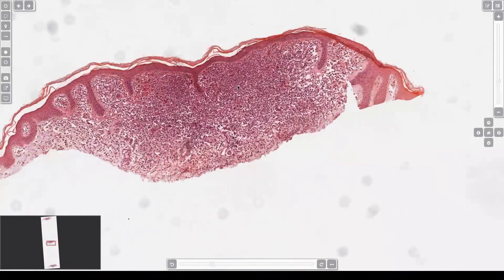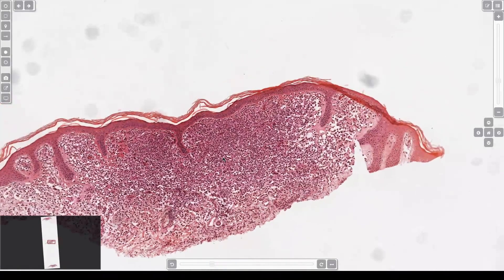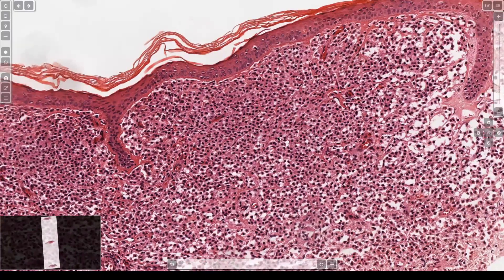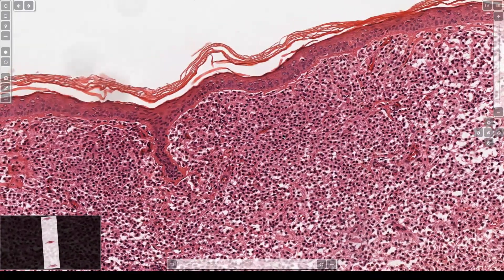Alright, dermal infiltrate — there are two types that tend to fill the papillary dermis: mastocytosis and Langerhans cell histiocytosis. The easy way to identify them, even without cytology, is the classic fried egg appearance, grooves, and coffee bean nuclei.